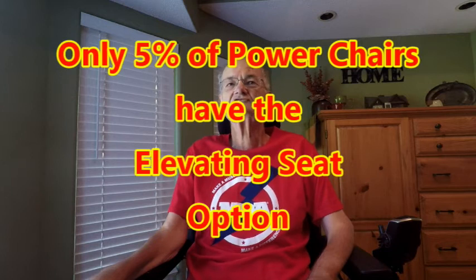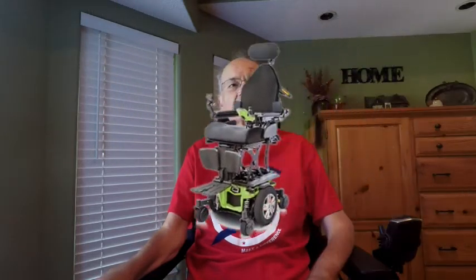If you have inclusion body myositis, you already know that your weakened leg muscles have or will soon prevent you from standing up from a seated position. Therefore, your selection of power chairs should include only those with a power elevating seat. As only 5% of all chairs available have the seat elevator option, 95% of all the chairs on the market can be eliminated as your possible choice. Identifying all the models and vendors that offer a seat elevator option must be a primary consideration. At the end of this video, I will list some of the models that include a seat elevator option.